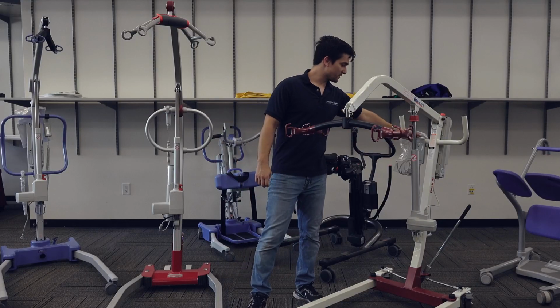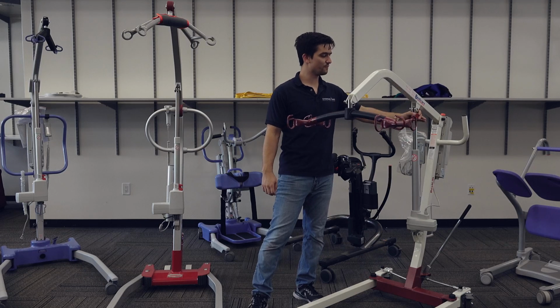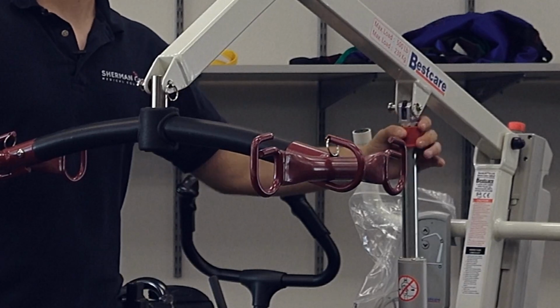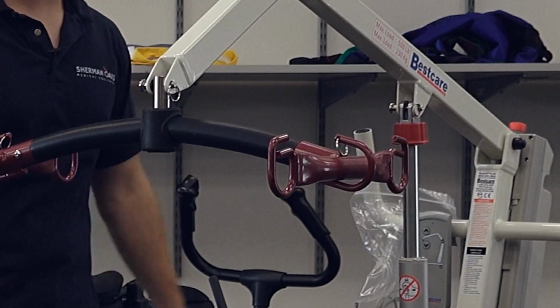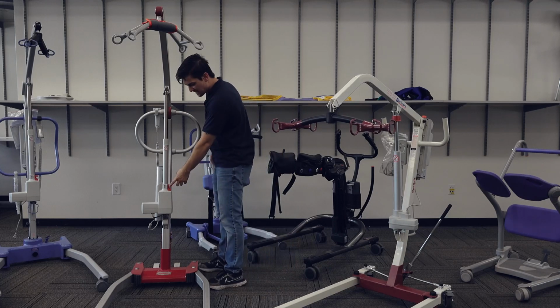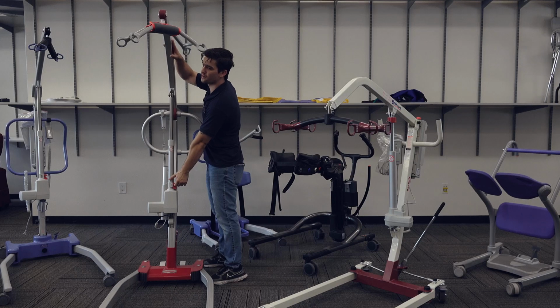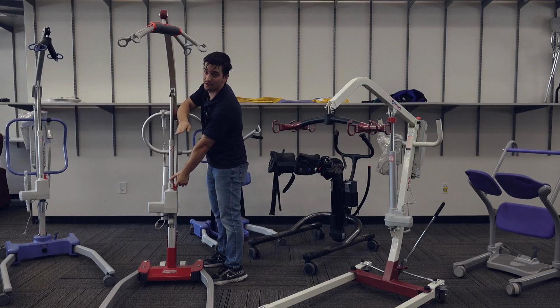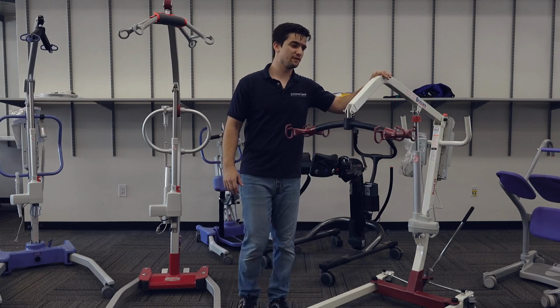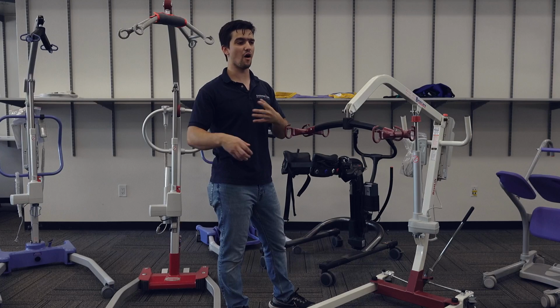With any electric lift, just in case anything fails, they have a red lever here by the actuator. So with this red lever, you're able to manually lower down if at any point the unit or the actuator may fail. On the MoLift, it's a little different of a motor, but again, it has that same red lever. So we would pull this up, and as long as there's weight on the boom here, it would begin slowly lowering down. On a full charge, on average, they're good for about 30 to 40 lifts. So if you're using it daily, every other day, or every night, it just depends on how often you're using it.